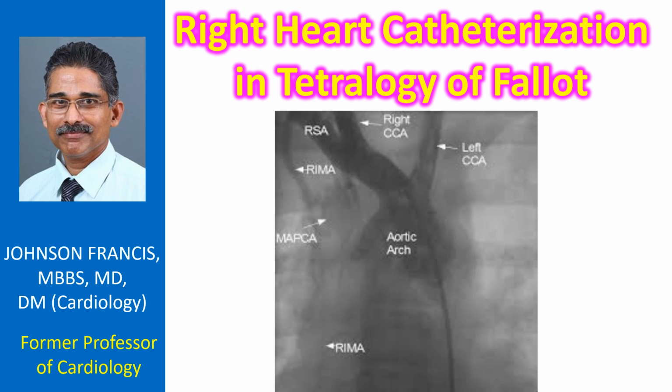The chances of precipitating a cyanotic spell are more when pulmonary angiography is attempted through the already narrow right ventricular outflow tract. Hemoconcentration is due to the diuresis following contrast angiography, which can be prevented by adequate pre- and post-procedure hydration.